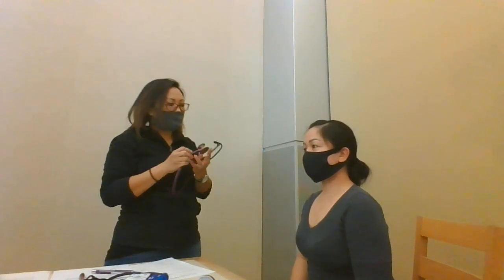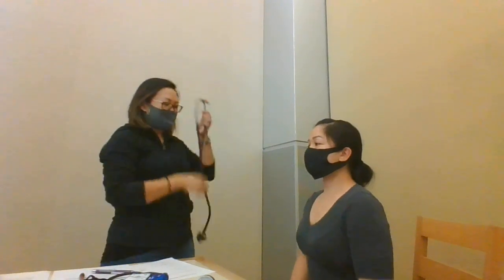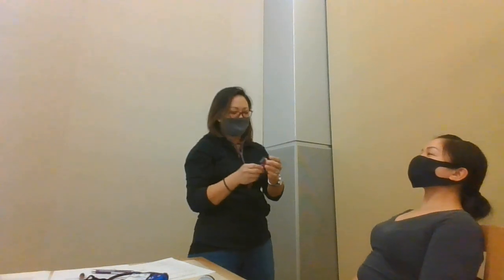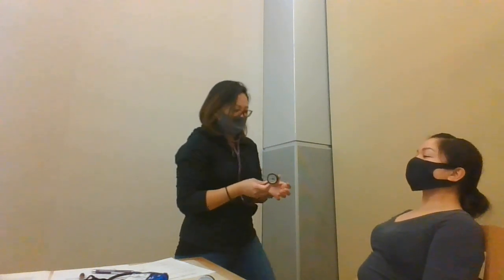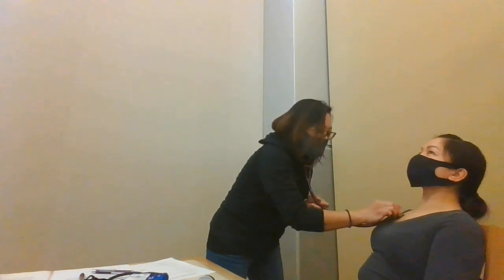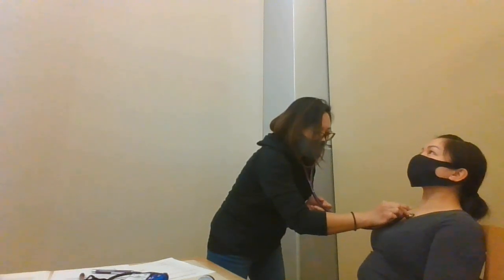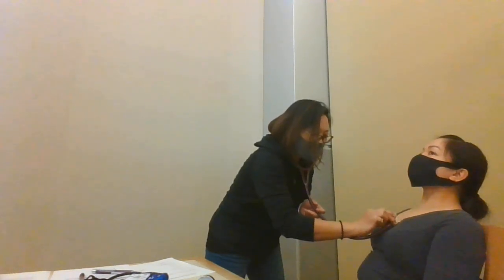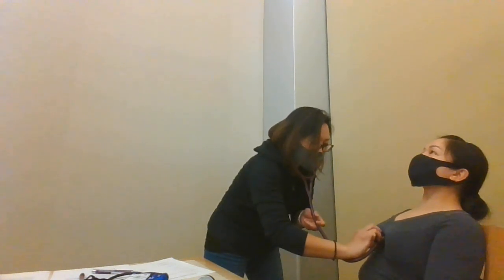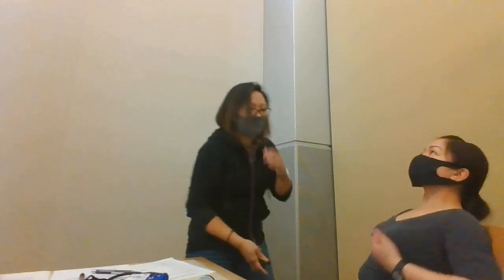I'm going to listen now this time with the bell, okay? Now I'm going to ask, do you mind laying down, Miss Romualdo? Okay. Pulmonic, Erb's point, tricuspid, and mitral. Okay, sounds good.